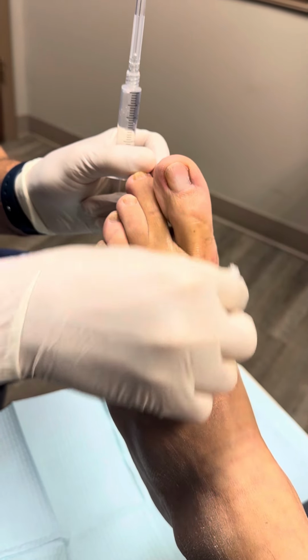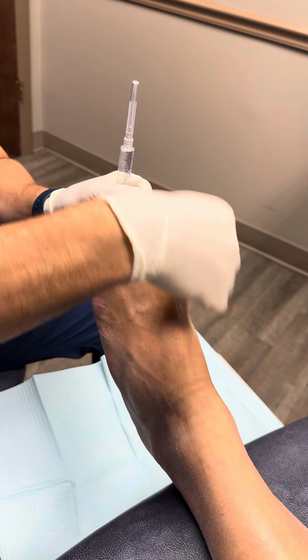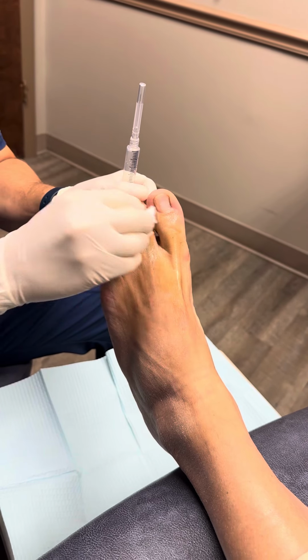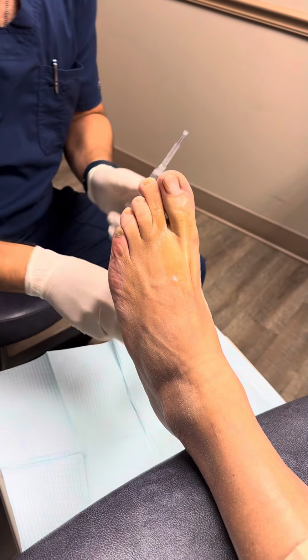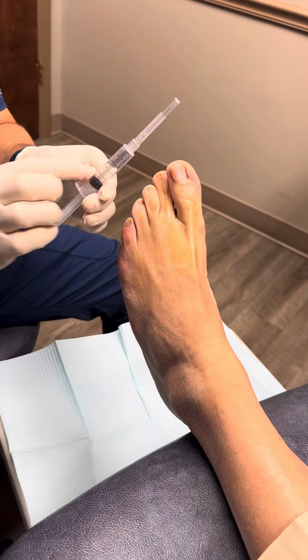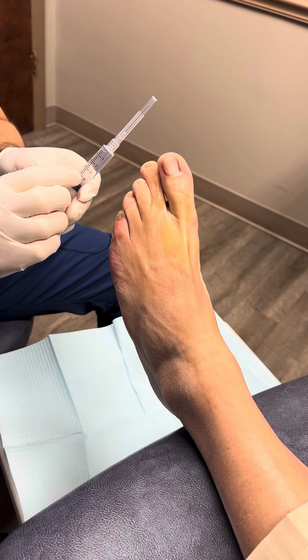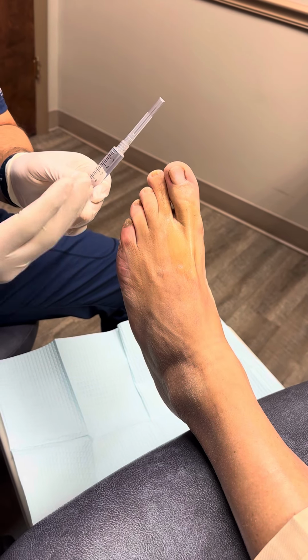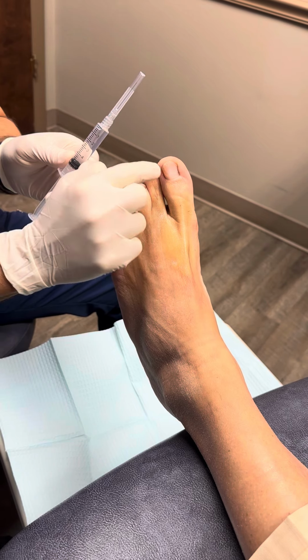I'm going to clean it with some rubbing alcohol first, okay? And we always tell our patients what we're doing ahead of time. So we're cleaning your toe with some rubbing alcohol. We're getting these spots nice and clean. We're going to go around the toe. And then we're going to inject him with some local anesthesia. This has what's called lidocaine, 1% lidocaine, and we use something called 0.5% marcaine. And lidocaine is short acting, marcaine is long acting. We're going to numb this whole toe so we can remove this corner.